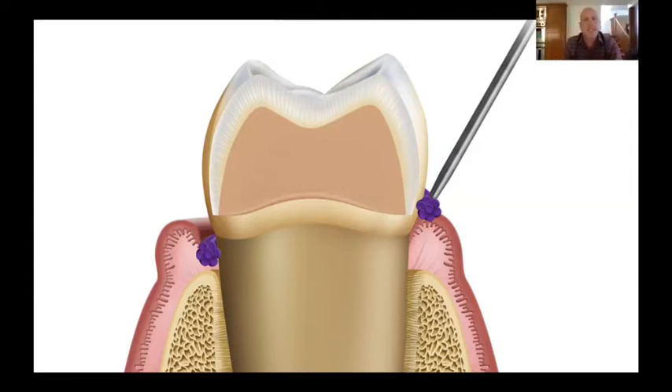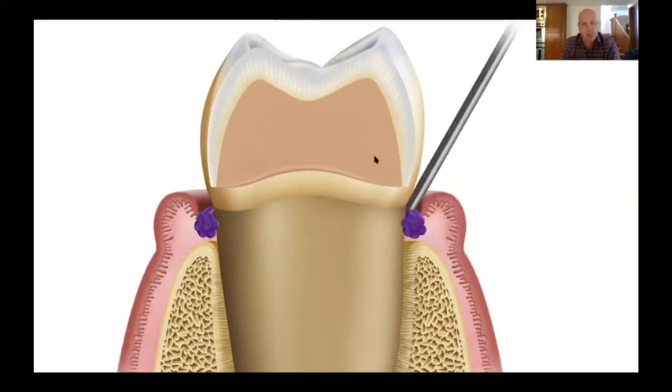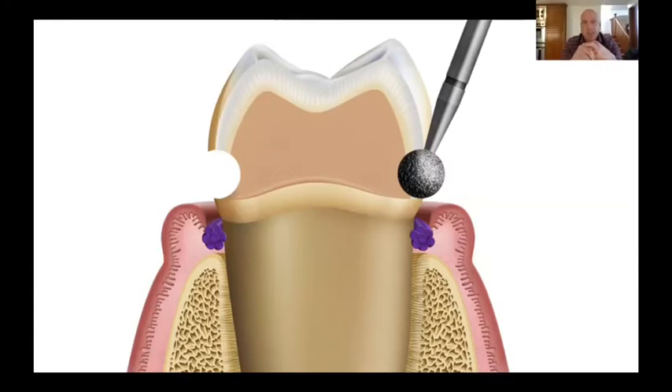The double zero cord goes into place in the sulcus. And once that is in place all the way down there, now we're going to prep our margin. That's why I call this the reverse preparation technique — because it's the exact opposite of what I was taught to do in dental school, which is to prep the entire tooth and at the very end prep the margin. I found that incredibly difficult to do. I've been a dentist now for 33 years, and I still think that's the hardest way to prep a tooth. That's the way every dentist in every dental school is taught to do it — and it works really well for the 5 or 10 percent of dentists who have really great hands, but it doesn't work so well for the other 90 percent.